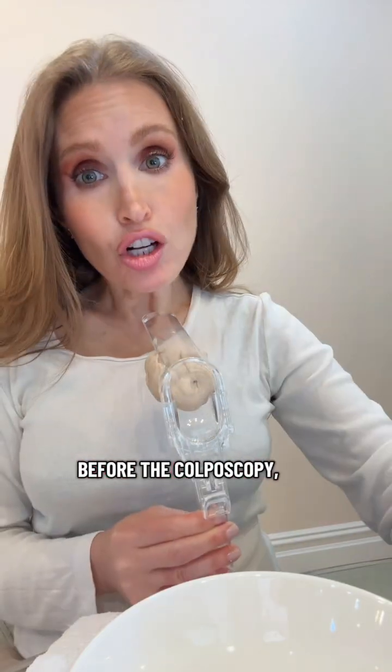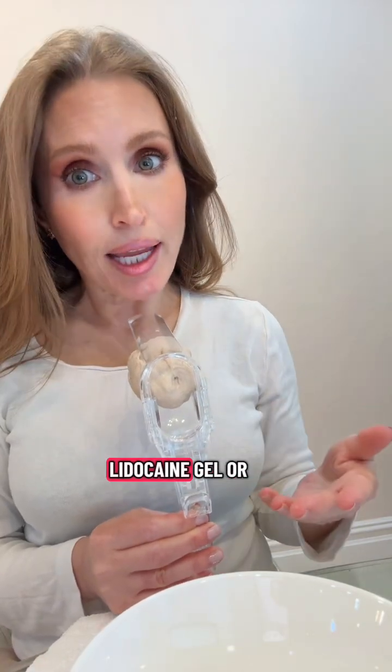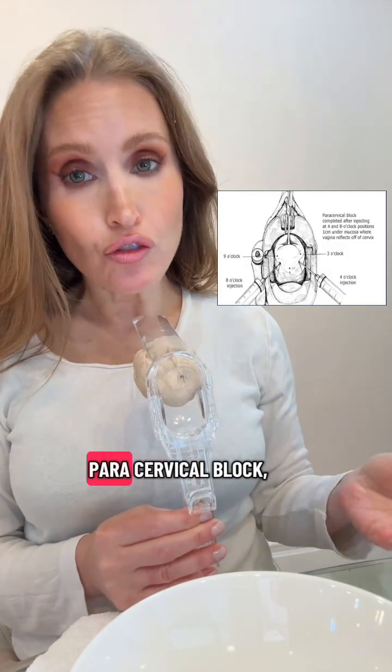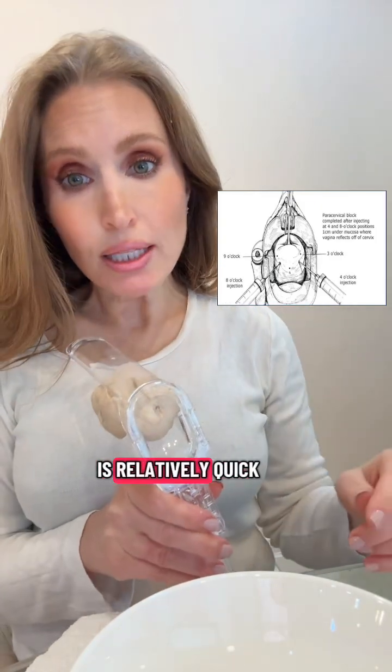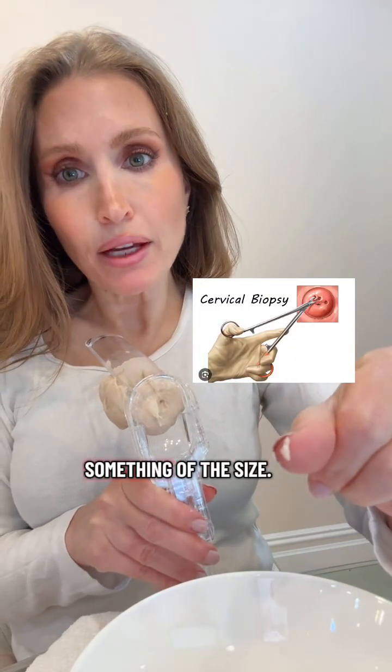Before the colposcopy, your doctor may give you some local anesthesia, which could include lidocaine gel or lidocaine spray, and sometimes a paracervical block, which is injections around the cervix. And this procedure is relatively quick, and the biopsies are extremely small. Nothing larger than something of this size.